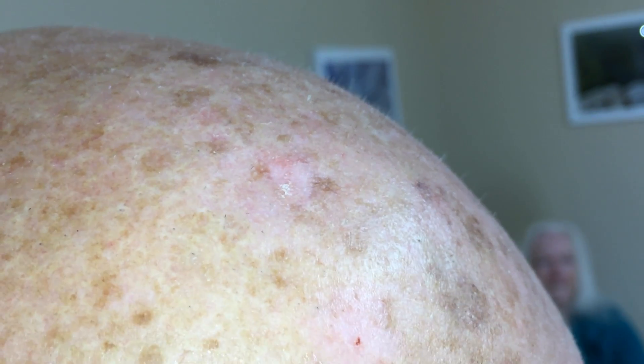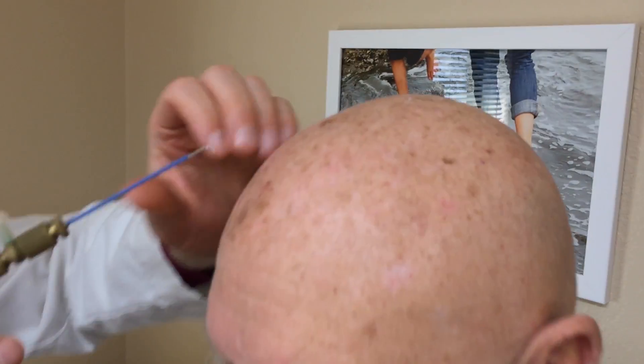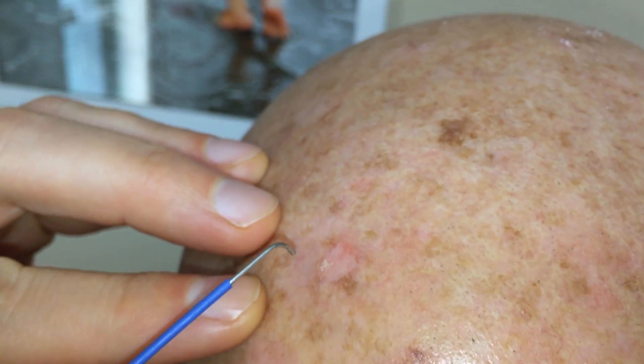You can feel it more than see it — it's this little crust here. We're going to get rid of all that crust. That keratin is being inappropriately produced by cells down here, and we're going to cause frostbite to get rid of this pre-cancerous growth.